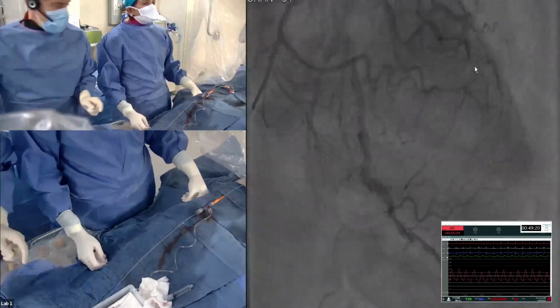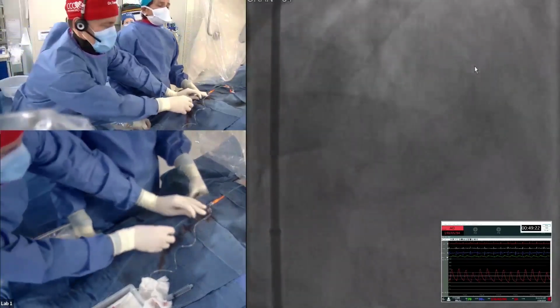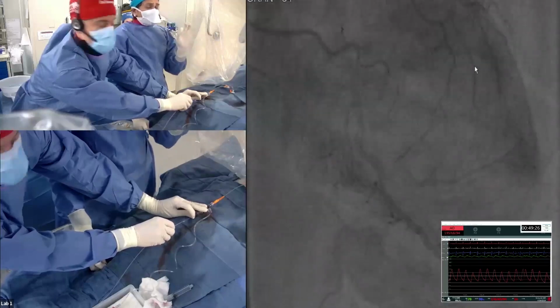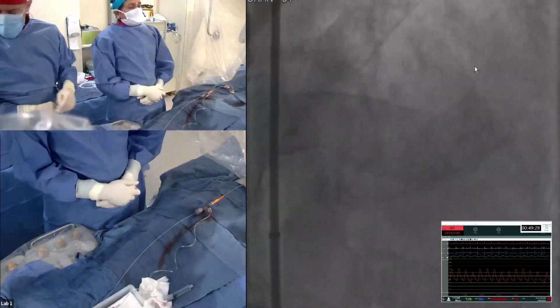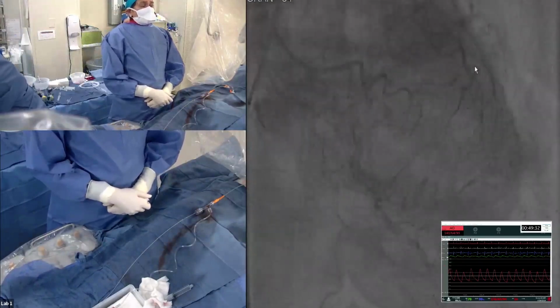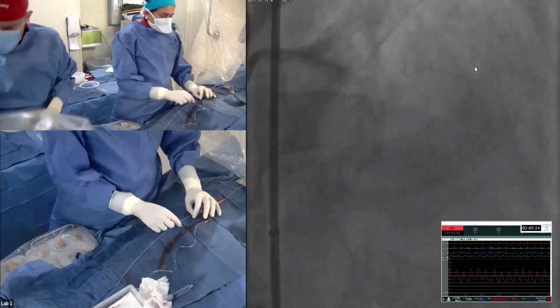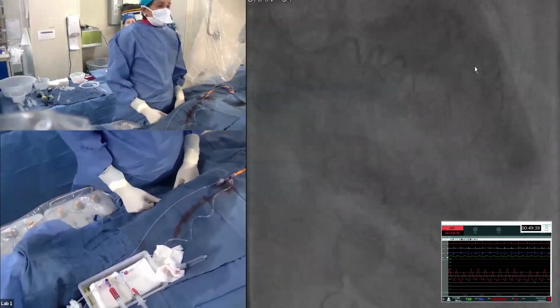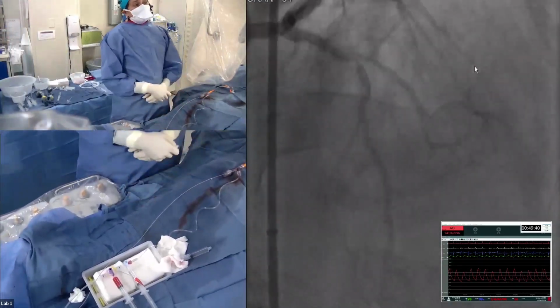That's a little concerning, still downgraded. If you see the first case we did, it was a short lesion and became aggressive, went to a 1.5 burr. But here with this angle, we have to be very cautious, and then of course I would go with the 1.25 burr just because of that.